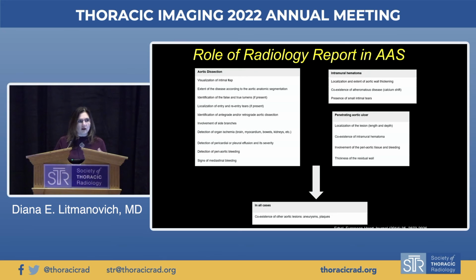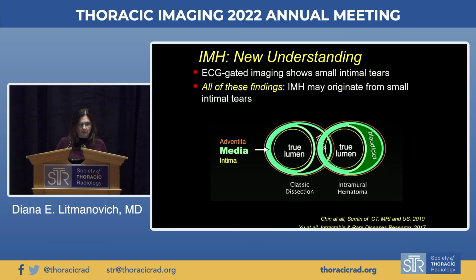This is just one of the suggested templates for reporting. This lecture is recorded, you can find it online. I'm not going to go into details, but it doesn't matter what structure you adopt, as long as you have a systematic assessment of everything we just talked about, then the report will be fulfilling and what your clinician will be expecting from you.